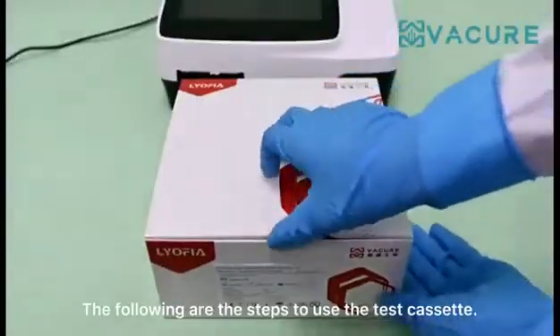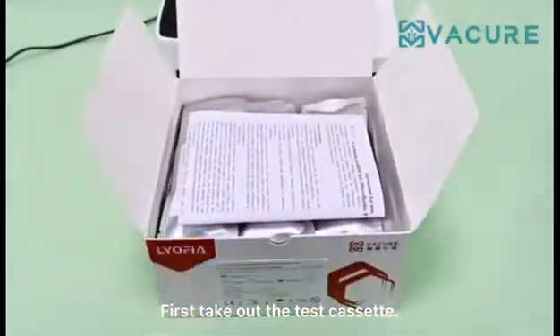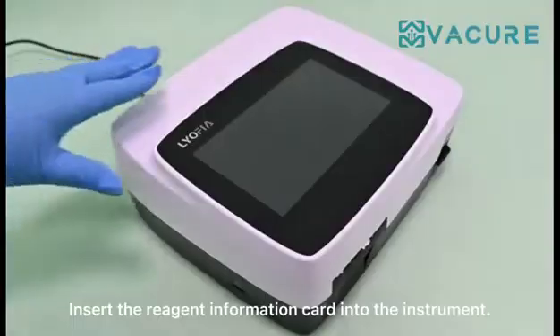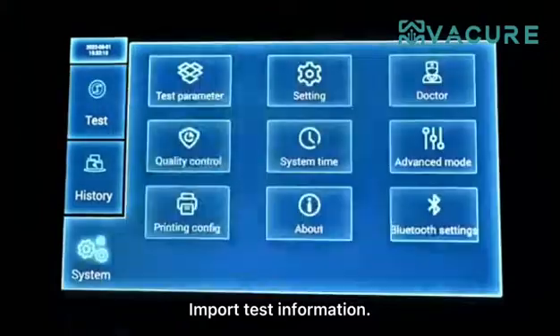The following are the steps to use the test cassette. First, take out the test cassette. Insert the reagent information card into the instrument to import test information.